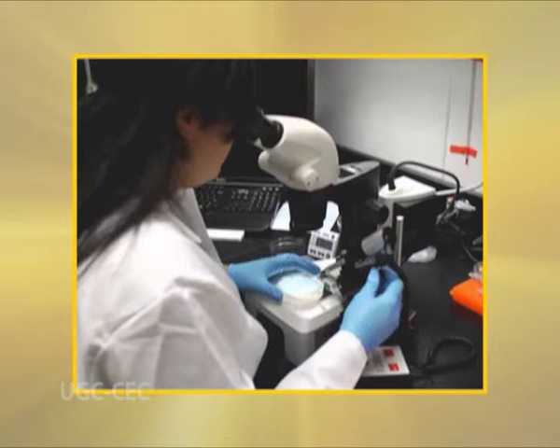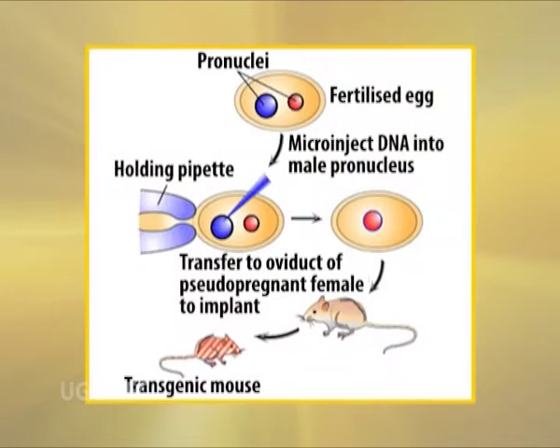The instrumentation for microinjection consists of a microscope of high magnification attached with fine needles, syringes, and other facilities to carry out the delivery of DNA into the selected cells automatically. The injected embryos are subsequently transferred into the oviducts of pseudo-pregnant surrogate mothers.